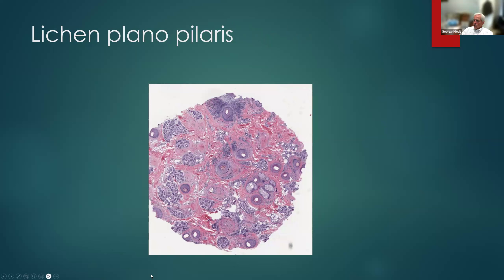Here's another cross-section of lichen planopilaris. We see a decreased number of follicles, and we can see this cross-section is at the level of the isthmus because there are sebaceous glands here. What we see is inflammation and loss of follicles, with inflammation at the level of the isthmus.